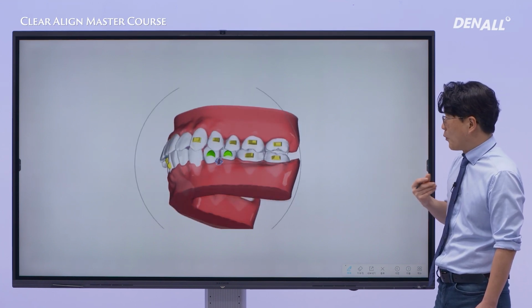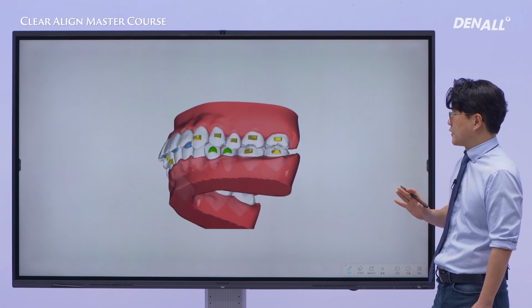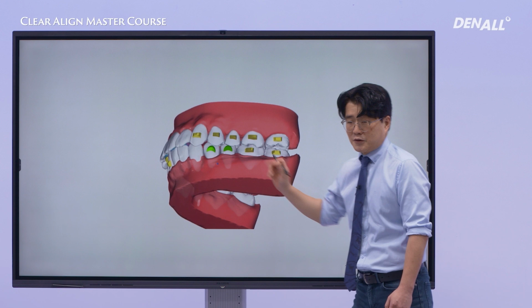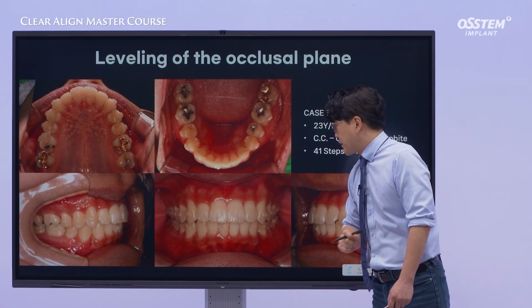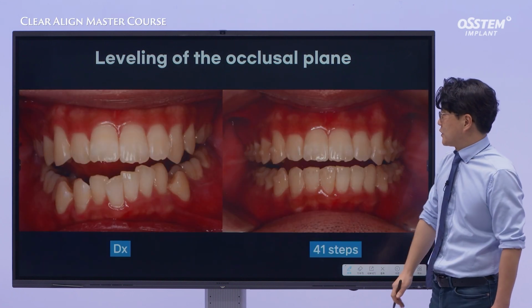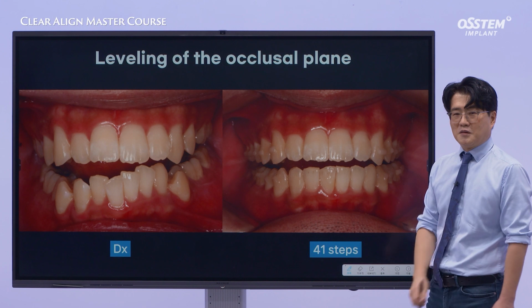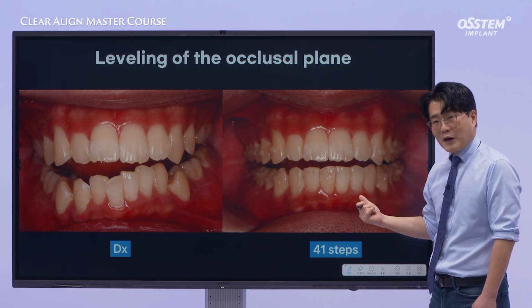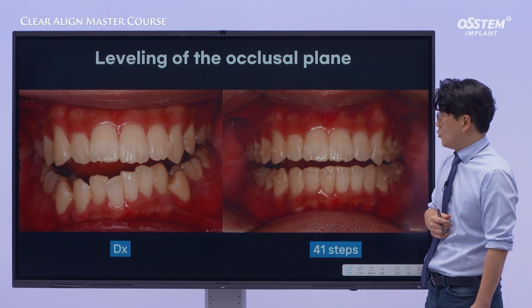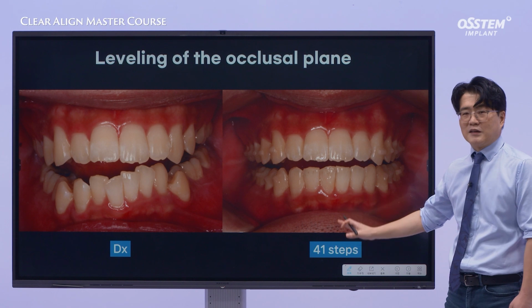At the same time, the lingually inclined second premolars are moved into buccoversion without any time delay. As you can see, this case was successfully managed over 11 months using 41 aligners. This case turned out well, but if it had been treated with brackets, given the perspective of managing deep bite, one might wonder whether it could have been completed within the same time frame.